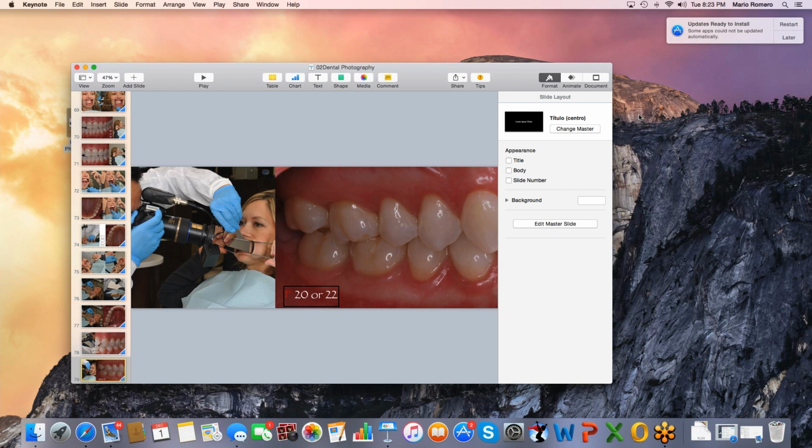glass mirrors, do not scratch. They don't get any scratches. Well, my mirrors had a lot of scratches, the metal ones. So they scratch just like any other mirror. You have to be very careful with them. They are very good. They're very nice mirrors. They reflect very well. You can take really good high quality photos with them.